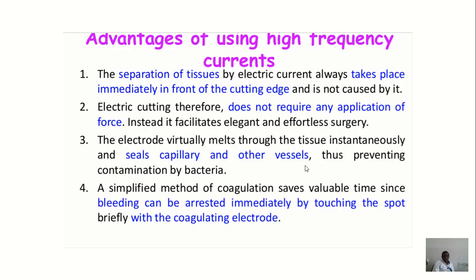The electric cutting therefore does not require any application of force. Without applying a big force, we simply touch the electrode or needle on the tissue, and immediately the cutting takes place. There is no need to apply force to the electrode. Instead, it facilitates elegant and effortless surgery, very smooth surgery. That is the advantage of the high frequency current used in diathermy.